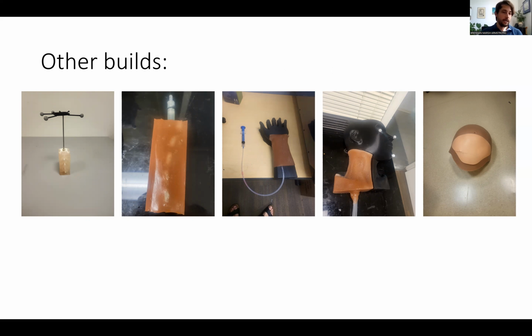So on the left here, you see a spine with 3D tracking bobbles on it because we're using Motive cameras to connect this to a custom Python script that I've written to allow you to sort of track where needles are in real time relative to the models, allowing you to get useful metrics for how well a procedure is done.